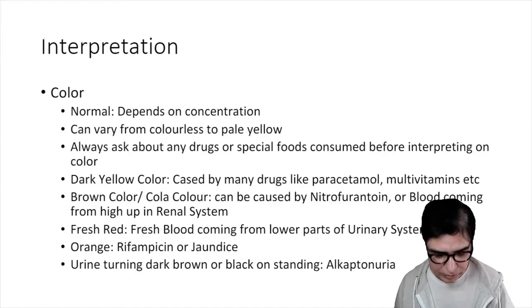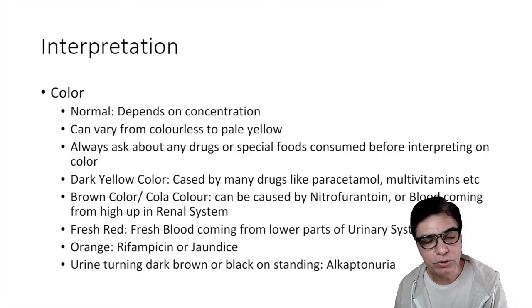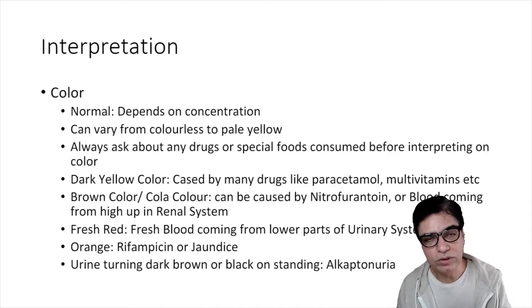Now, how do we interpret? So the first thing when you are doing a urine dip is that obviously you would need a urine sample. Now, it's very important that this sample should be a clean catch. Remember, gone are the days when we would put cotton wool in the nappies, because that leads to a lot of false positive results. So you need a clean catch.